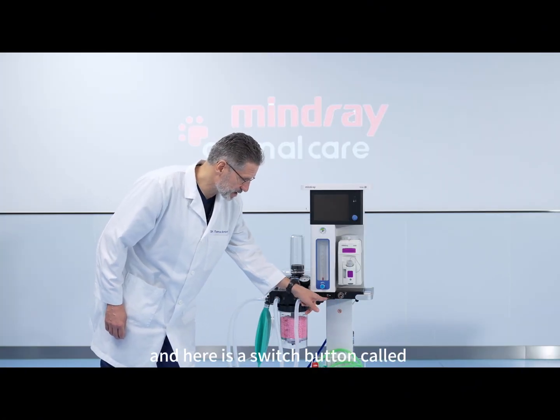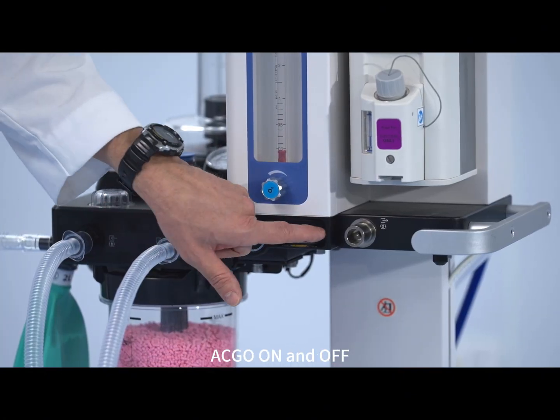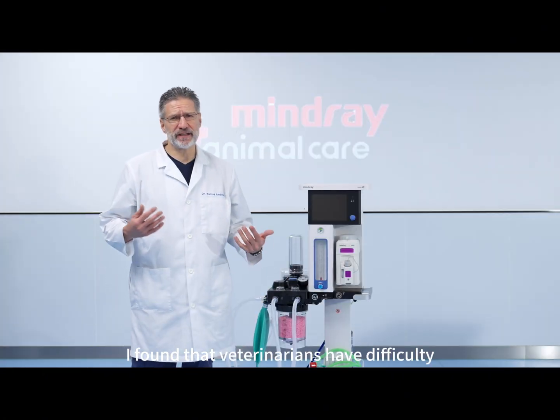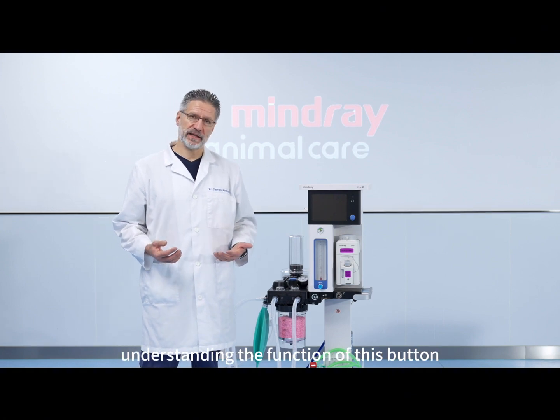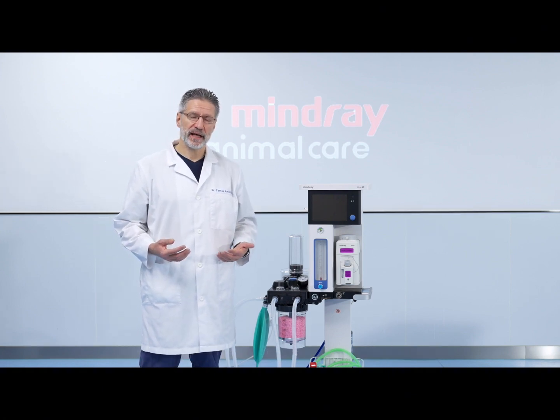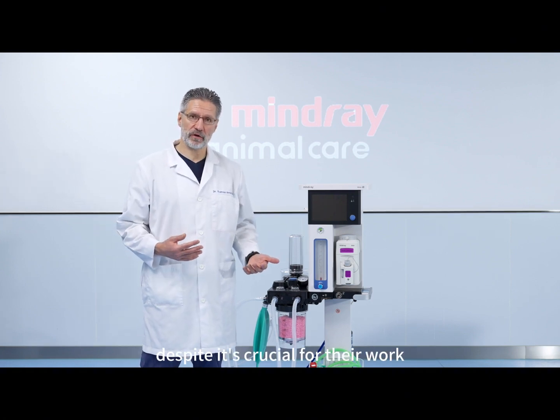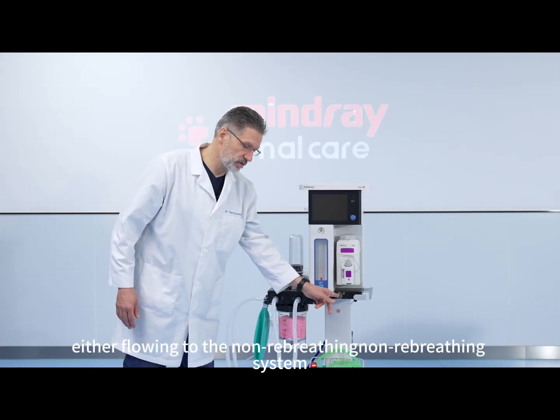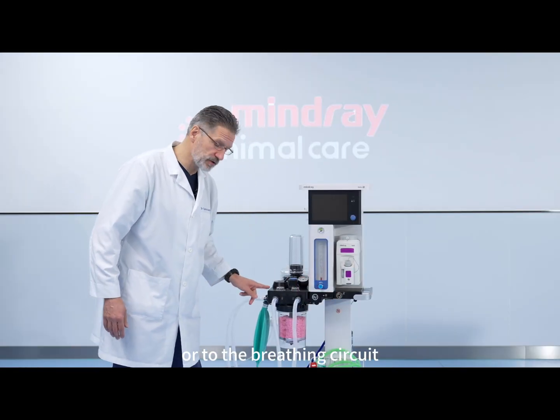And here is a switch button called ACGO on and off. I found that veterinarians have difficulties understanding the function of this button, despite it being crucial for their work. This button will divide the fresh gas either flowing to the non-rebreathing system or to the breathing circuit.